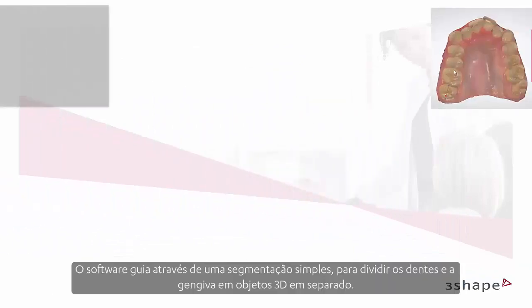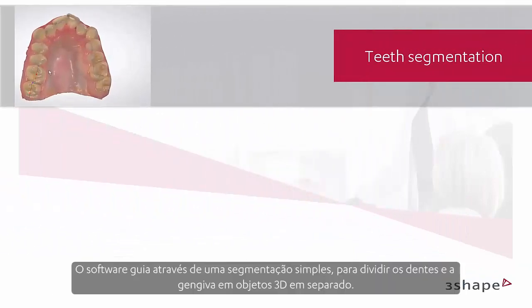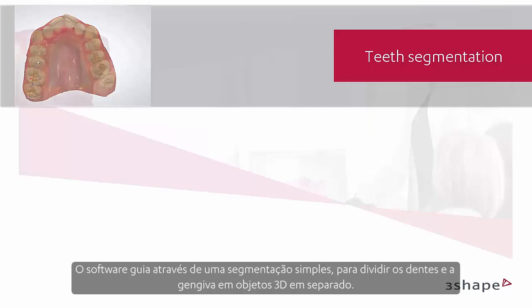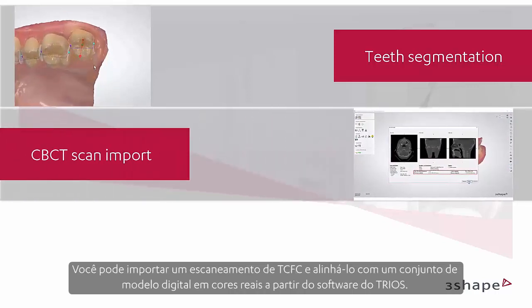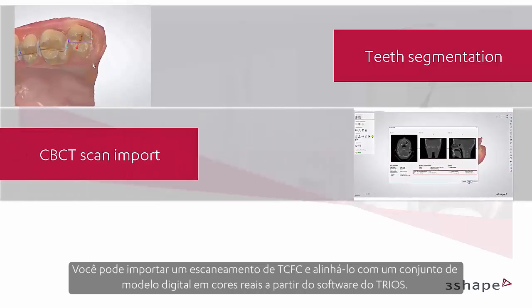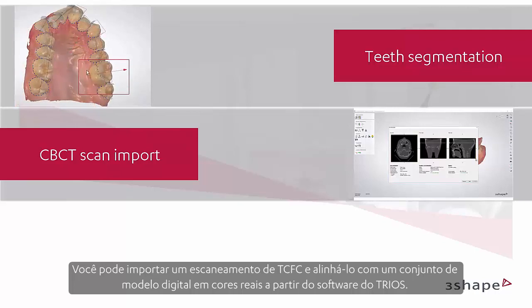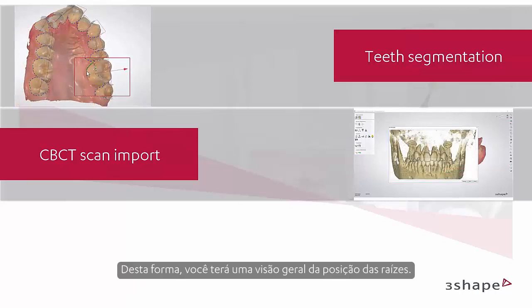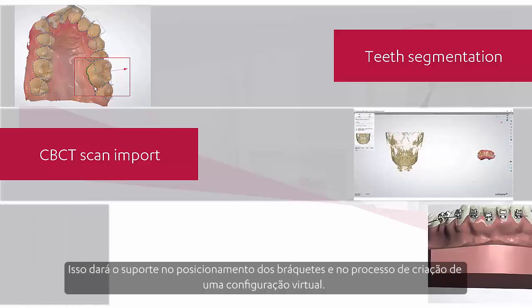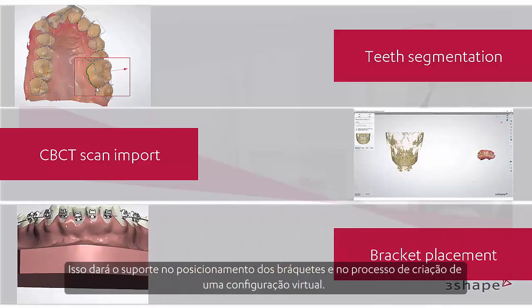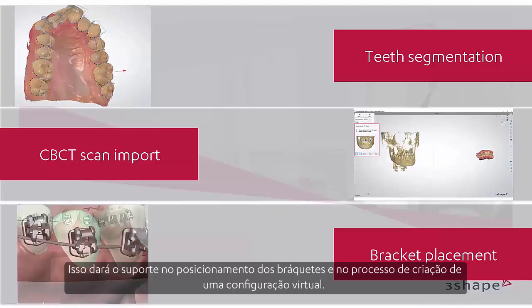The software guides you through a simple segmentation to divide teeth and gingiva into separate 3D objects. You can import a CBCT scan and align it with a real color digital model set from the Trios software. In this way, you will have an overview of the root positions, which will support you in bracket positioning and the process of creating a virtual setup.